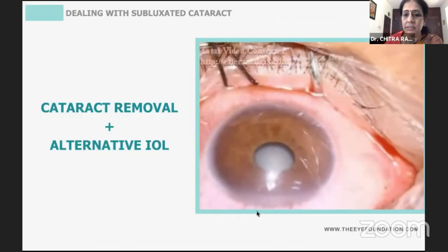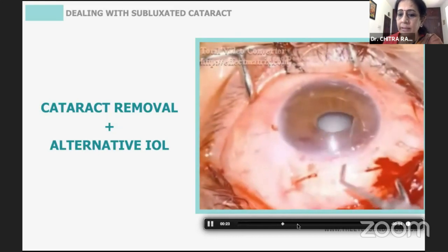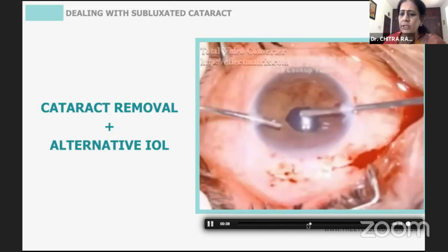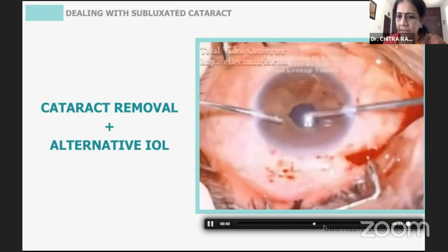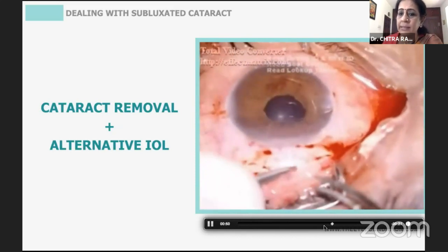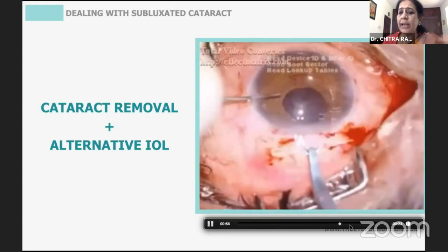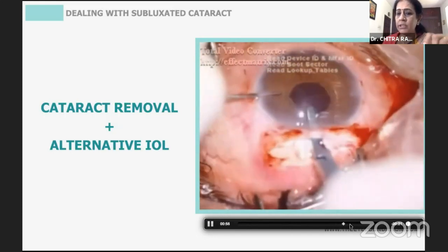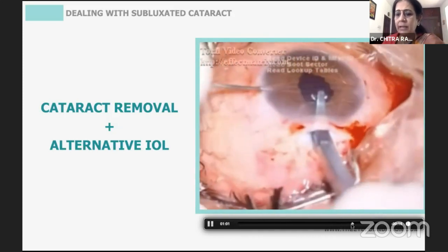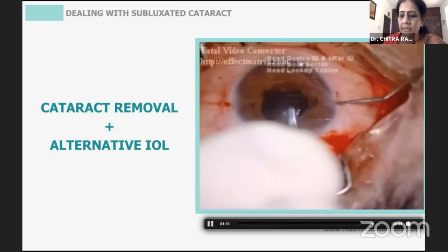For truly severe subluxation, a scleral tunnel is created and the lens is removed with a vectus. The pupil is small, requiring a little anterior vitrectomy; pilocarpine is not needed in these eyes. An iris clip lens is the easiest approach — 3 o'clock and 9 o'clock incisions are made, the iris clip is stabilized, placed behind the iris, the haptic is tucked into the iris tissue on both sides, and the surgery is done.